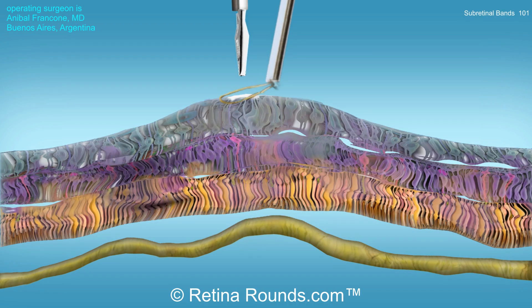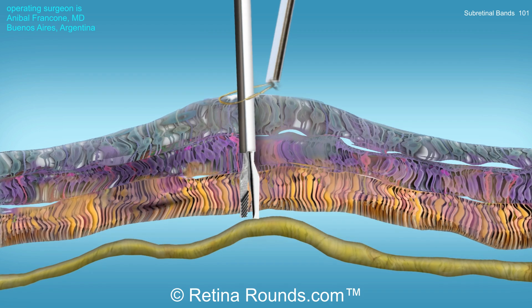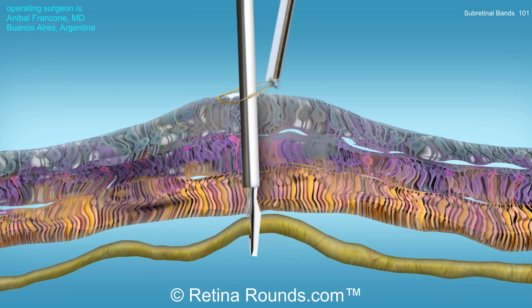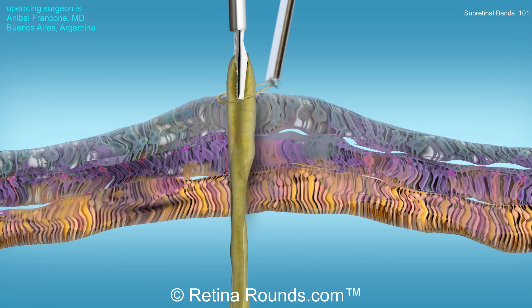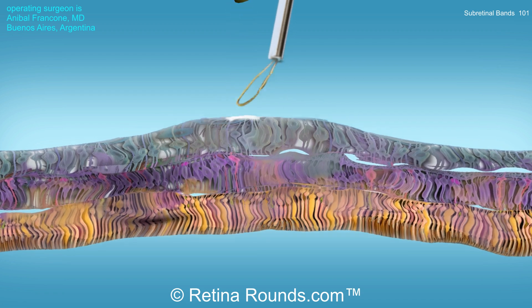Here's an animation of Dr. Francon's modification, which he calls the napkin loop technique. A flex loop is placed over the retinotomy to create countertraction, holding the retina down while the subretinal band is being removed. In the process, one can avoid many of the complications just discussed.